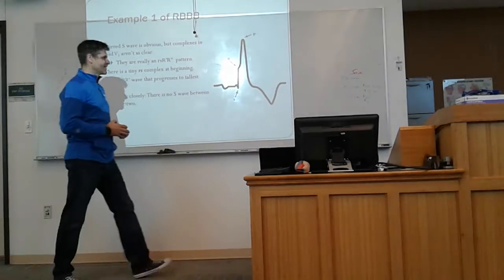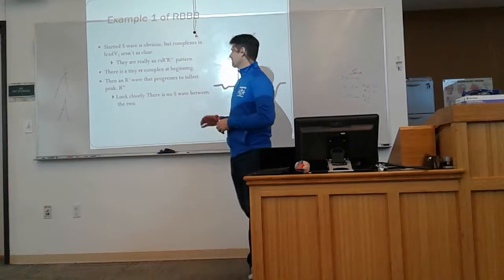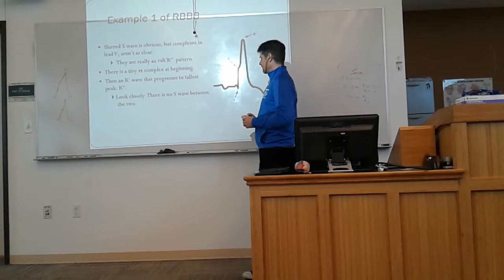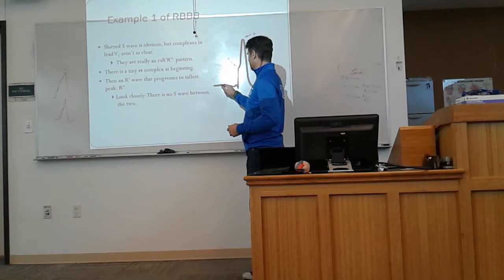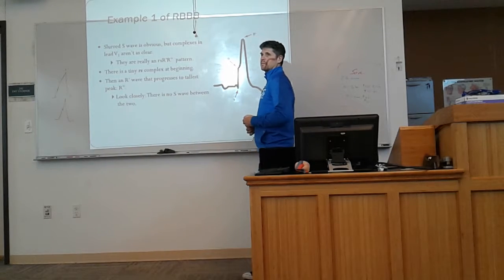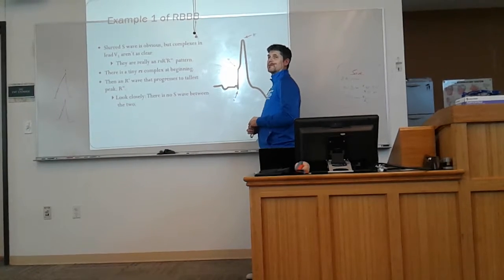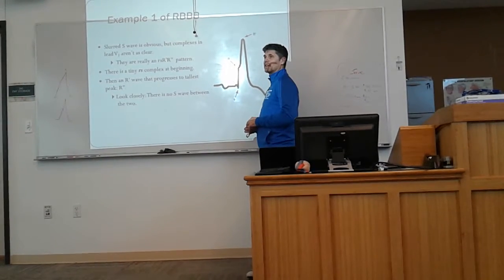How are you able to tell the difference for where your P wave is on that? Because that could be an inverted P wave, or why isn't that little R nub right there a hidden P wave? That is a P wave. It is inverted. So that's a junction. How did you know? What lead are we looking in? V1.